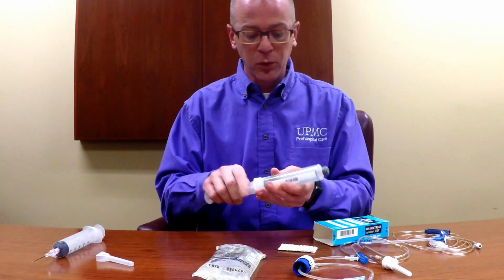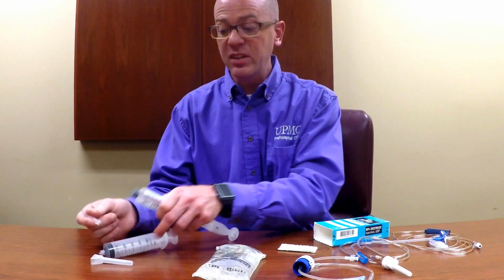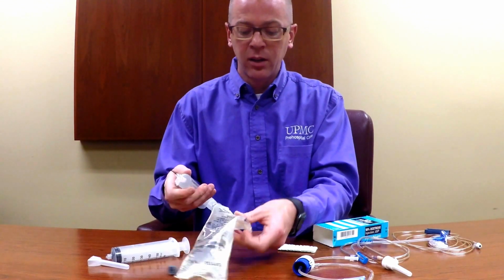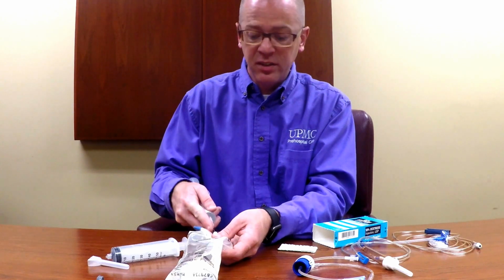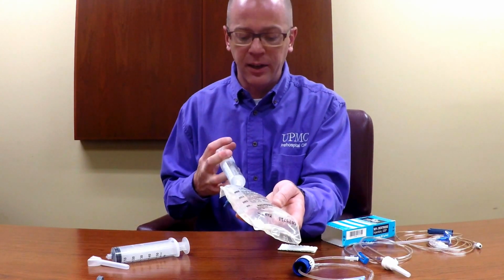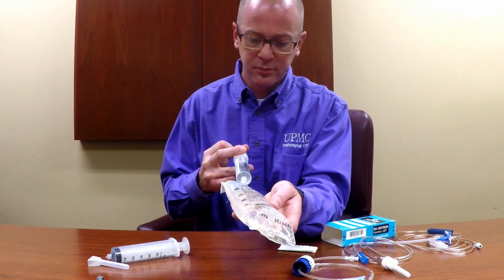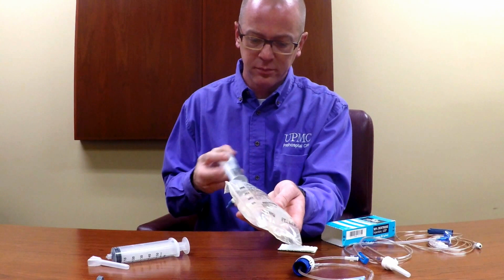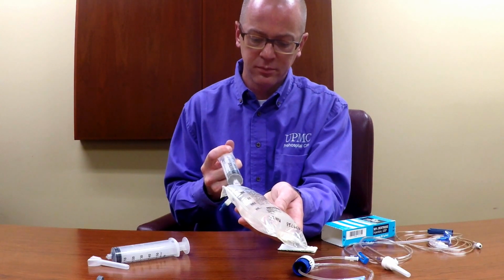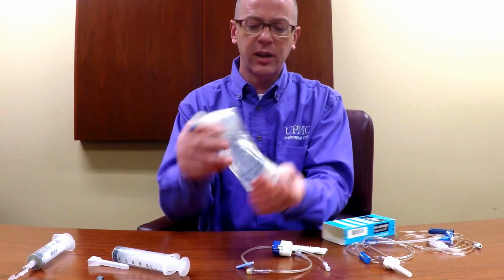So once I have 200 cc's of fluid volume remaining, I have an amp of D50 that again is 25 grams of dextrose and 50 cc's of fluid. If I inject this volume back into this 200 bag, I've created a solution that's 250 cc's of total volume with 25 grams of dextrose, or an appropriate solution of D10. Now that I have my drug and my fluid volume correct, I can give it a quick shake to ensure that it's appropriately mixed.